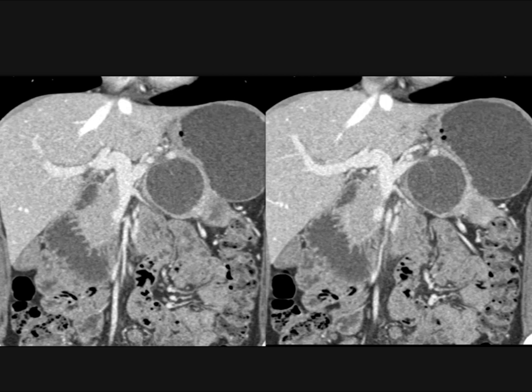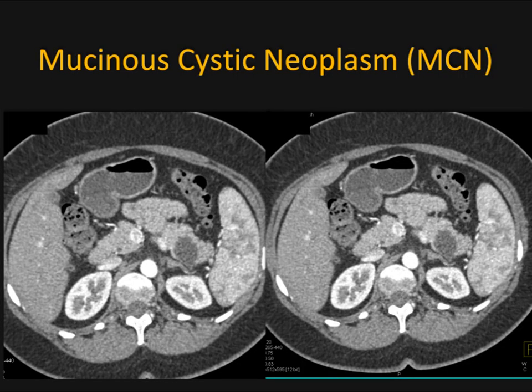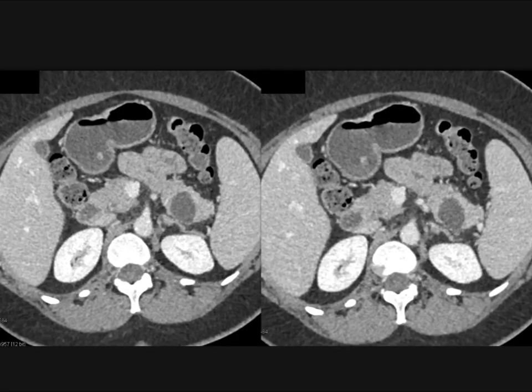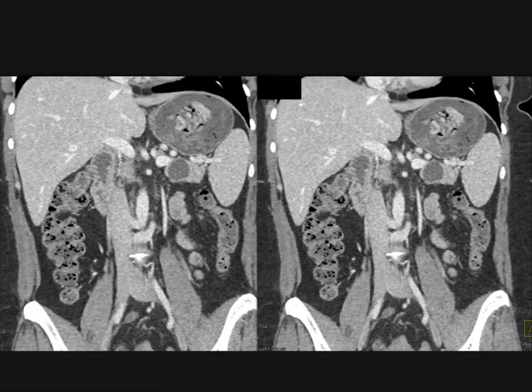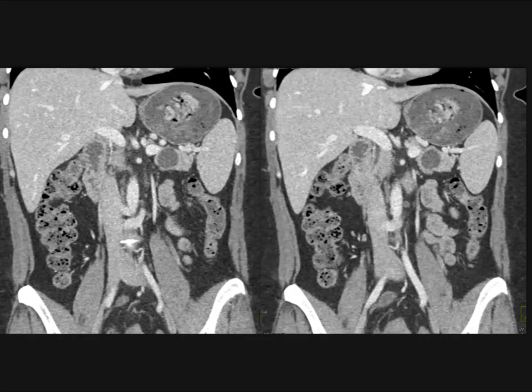Another example that looks identical to the last case but is smaller — roughly three centimeters. The rest of the pancreatic gland enhances well. It's a bit eccentric, which is not uncommon particularly when lesions are smaller. There's no evidence of a dilated pancreatic duct. If this were an IPMN, there would be a dilated pancreatic duct or you would see communication with the duct. Could this be an oligocystic serous cystadenoma? Possibly, but it's not the best location. Here it is on the coronal view — just nice examples of how the image looks.